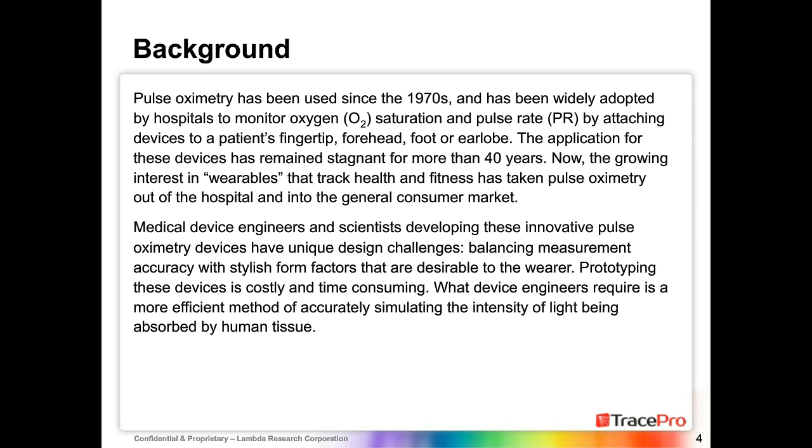The application for these devices has remained pretty much stagnant for 40 years. But in the past few years, there's been a very large growing interest in wearables for tracking health and fitness. And that's where we've taken pulse oximetry out of the hospital and into the general consumer market.